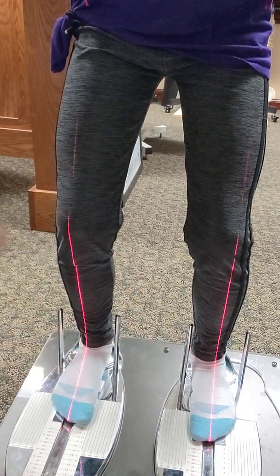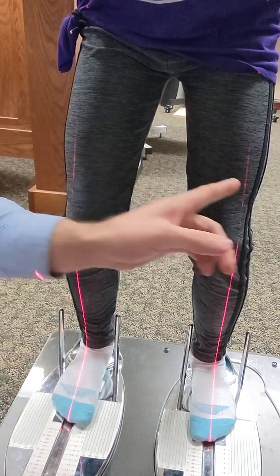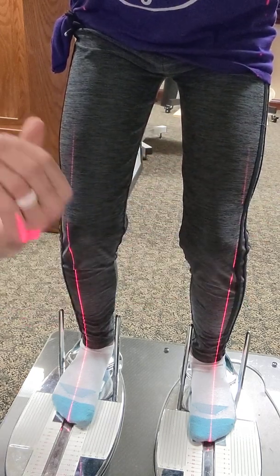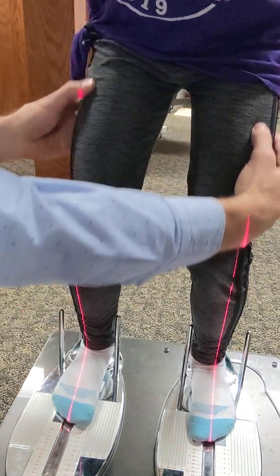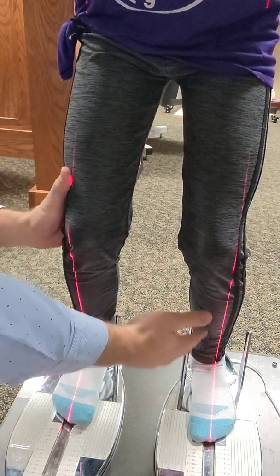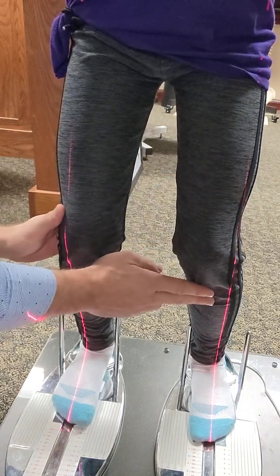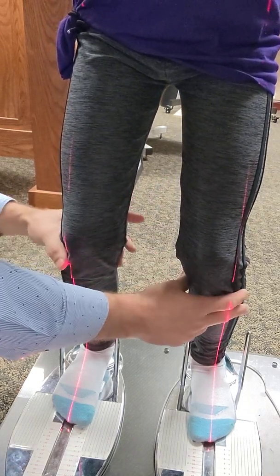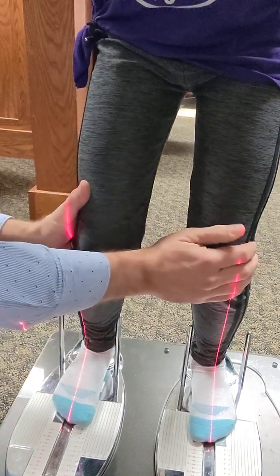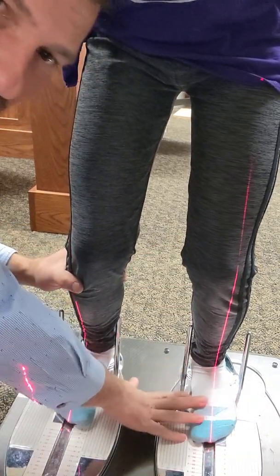The other thing you can see is when you look at these lasers — since she's over-pronated, you can see how this laser is going to the side of her leg. That tells us these muscles are doing all the work. So in the future, if we don't correct this, she's going to be more prone to IT issues, more prone to ACL sprain and strains because of that internal tibia rotation. She's going to have more knee problems possibly. So we really want to work on stabilizing and correcting this.